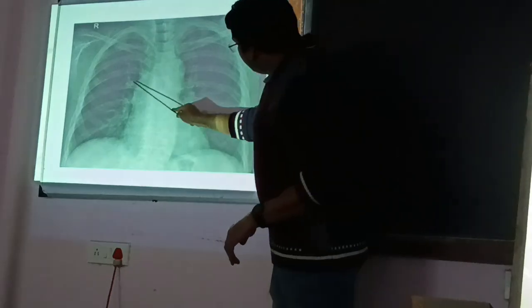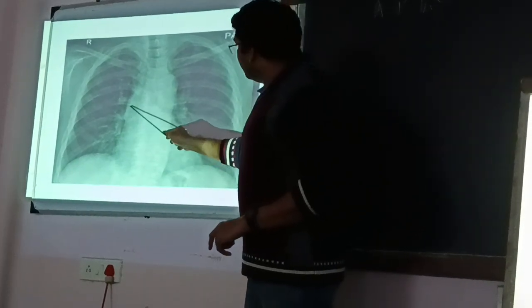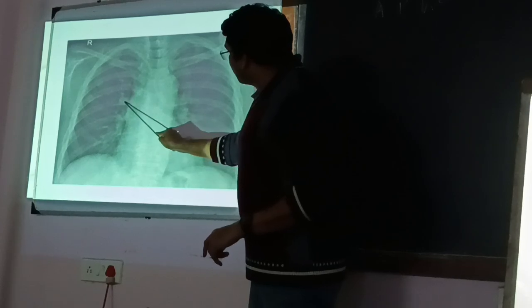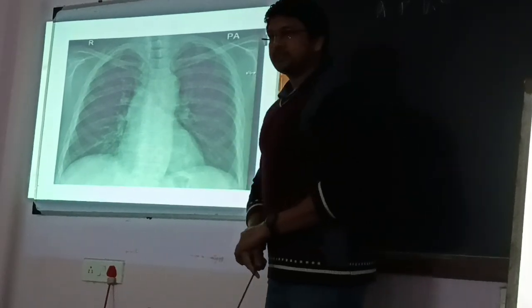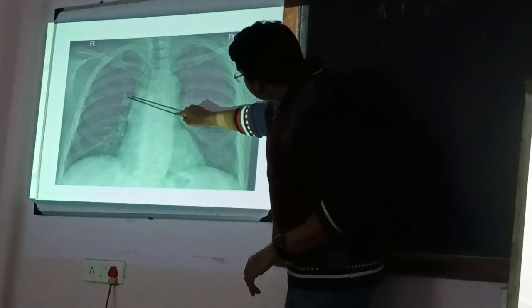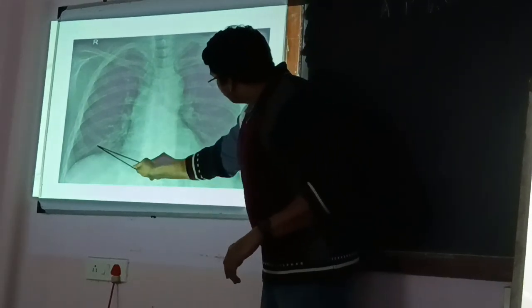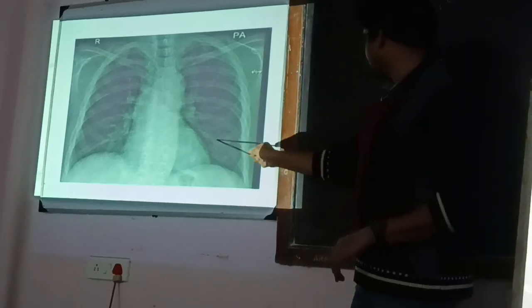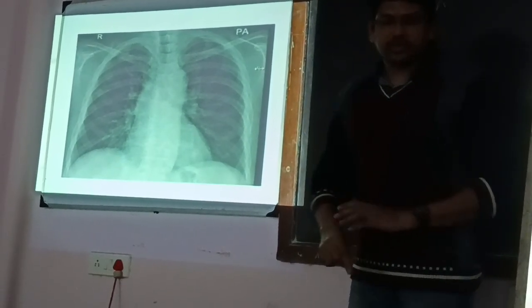And here you can see a few whitish structures at the hilum. These whitish structures are like multiple dots and whitish lines also. You can see multiple dots over here, and also multiple lines. Could you able to see the lines? No? Okay, can I show you that?